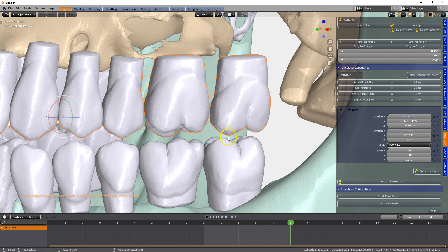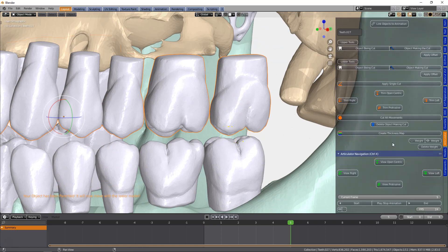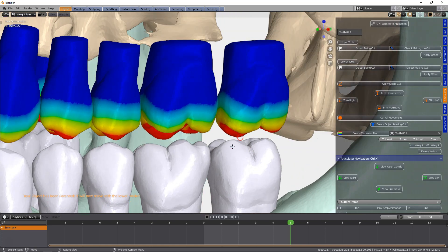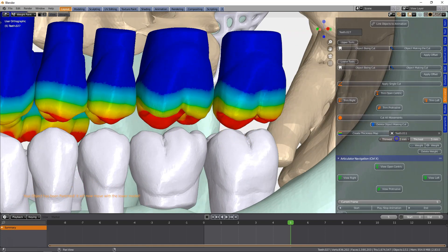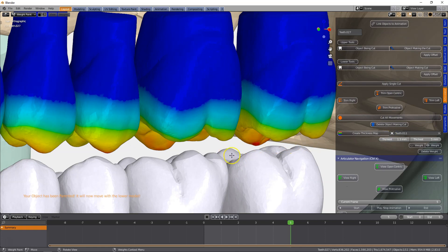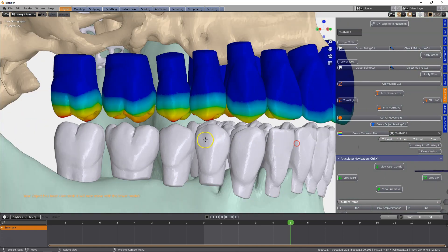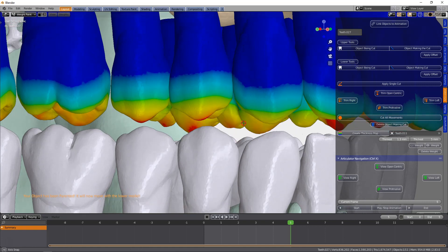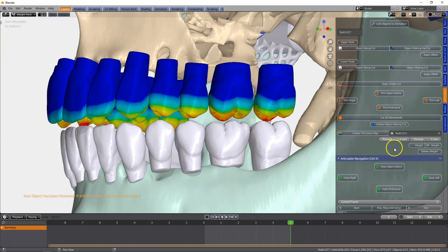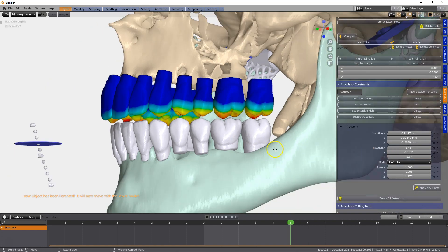For example, if we're making a splint we would have to look at the distance of the last molars, and we've got a thickness map where you can simply look at the thickness. The red zone is two millimeters, and by using the slider we can determine exactly how far away the molar is — at this position it's 1.3 millimeters, which is a little bit thin for a splint. So we can measure the distance between the two arches.